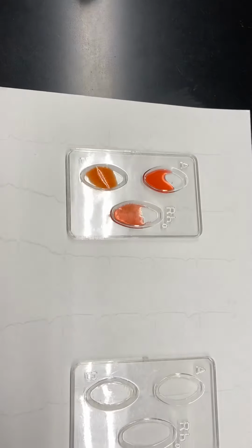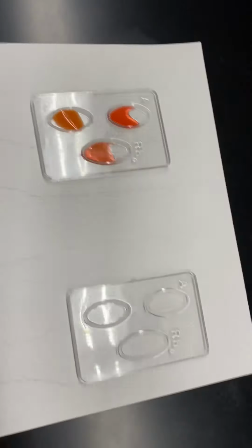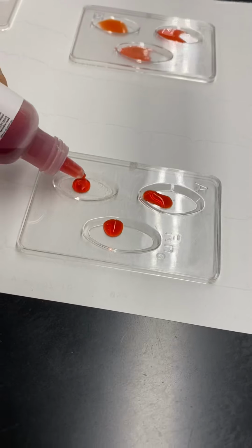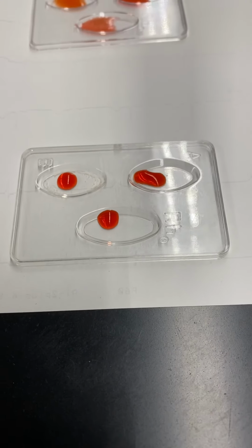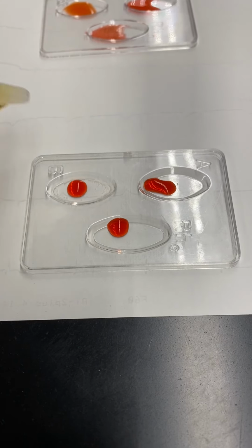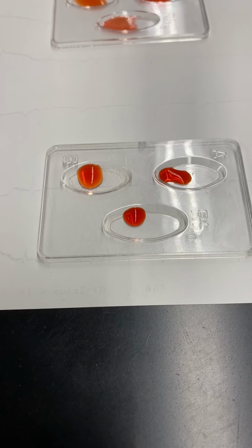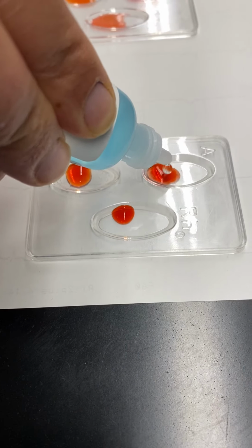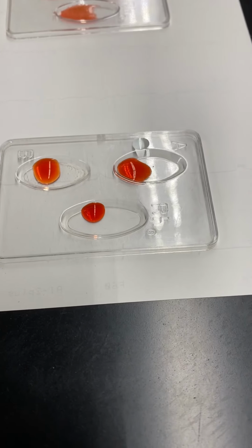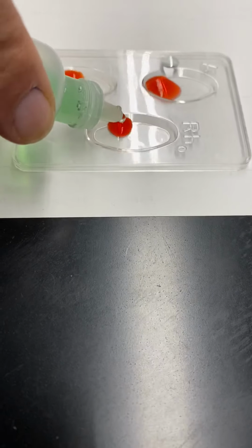So for Mr. Green, the reaction was observed in RH and in B. Now let's go ahead and repeat this experiment with Ms. Brown. Again, I'm going to do the same steps. So a couple of drops of blood sample to all 3 wells, and then match the corresponding anti-serum to each of these. So I have my B, I have A, and then I have my RH.